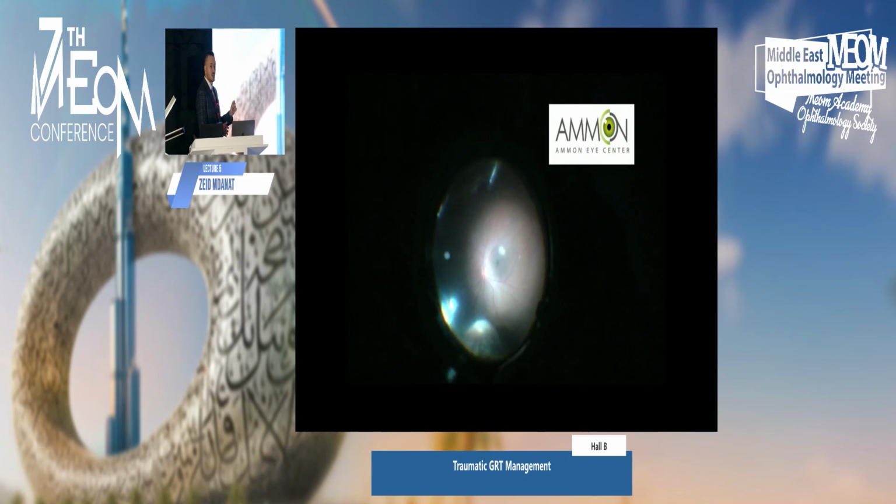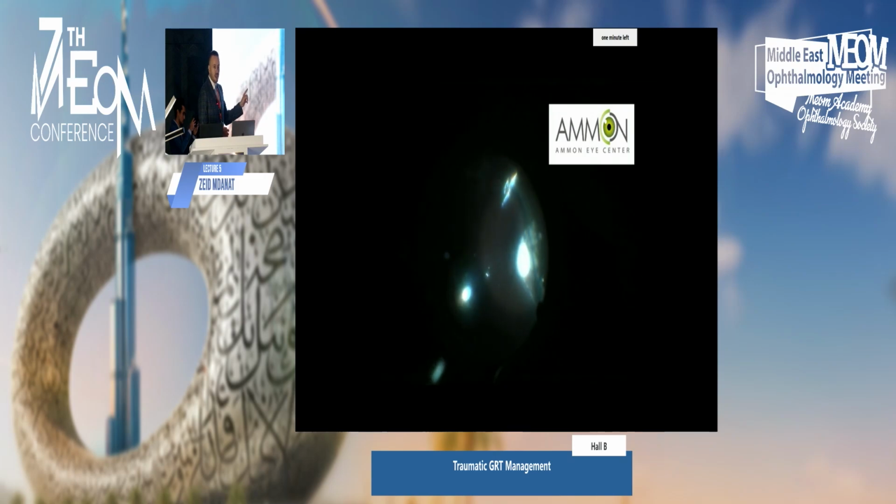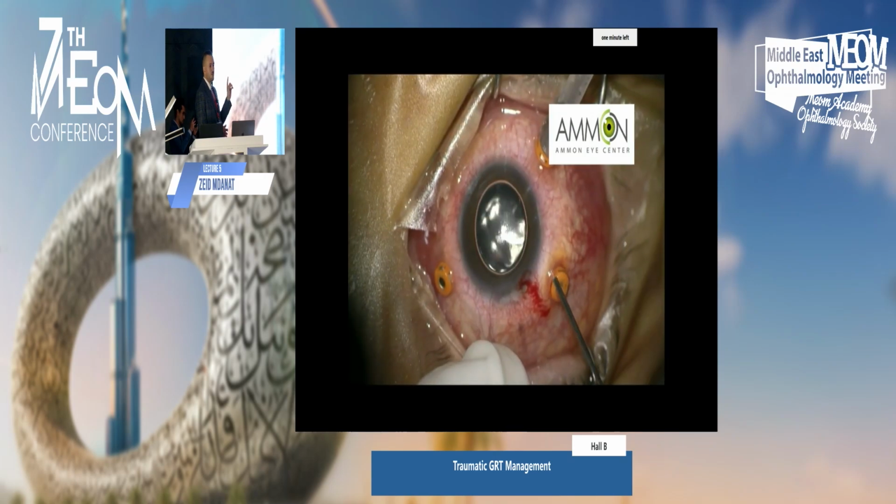The horns of the GRT, I tend to cryo. So I do a couple of rows around the horns, and then I apply cryo to the 2 horns of the GRT. Now, what I do here is I basically leave the PFCL inside the eye for about a week.